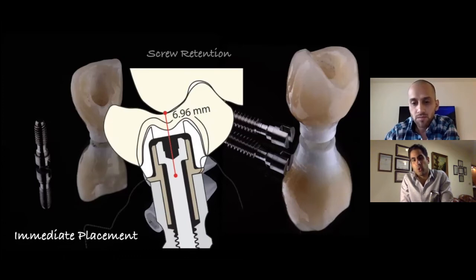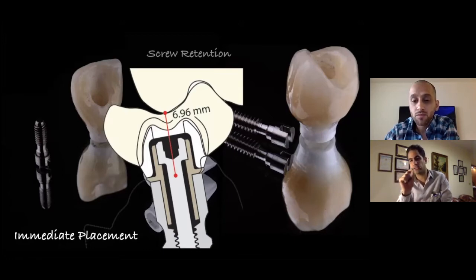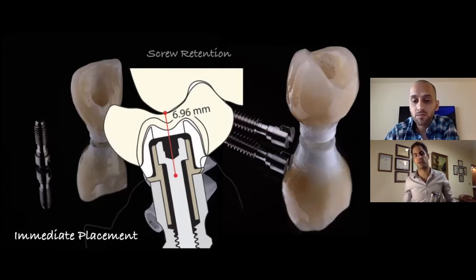One of the problems usually in short interocclusal spaces is that you can see the darkness of the abutment through the porcelain or zirconia at the top. So in that limited amount of space, is it okay to cover that? Is there any technique, or are we forced to see the screw access hole at the occlusal part?